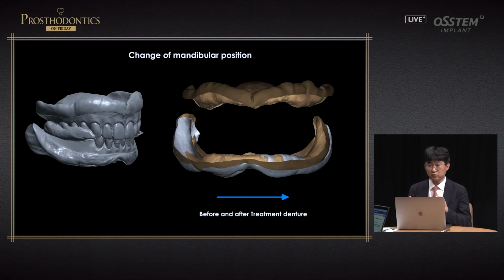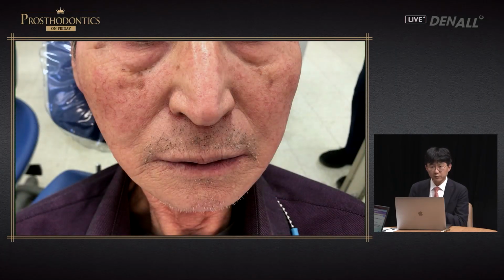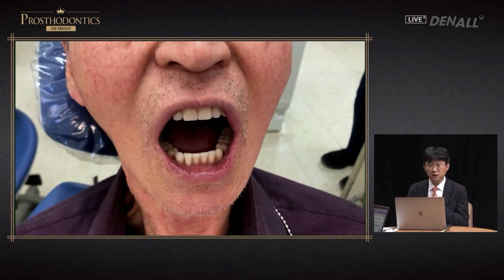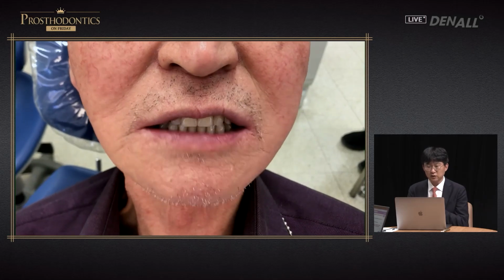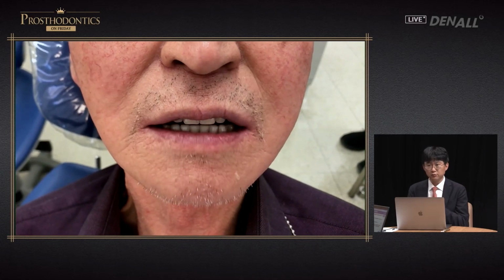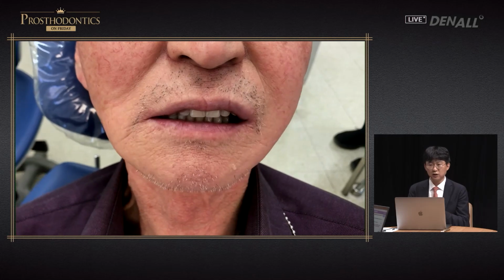Against the maxilla, the whitish portion on the right-hand side is the portion changed in the mandible, and the dislocated joint became a little bit better positioned with widened TMJ space. Even though TMJ is not perfectly corrected, the patient established a stable position, and I've observed the patient for about 3 years, and the tapping point is not changed, and repeatedly the midline is not changed, and the chewing is performed pretty well in this position.